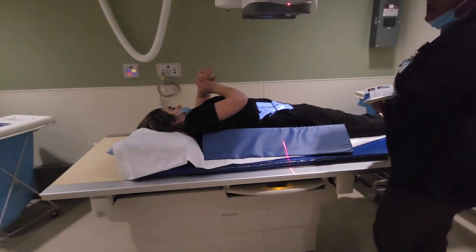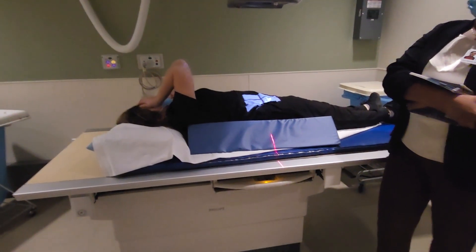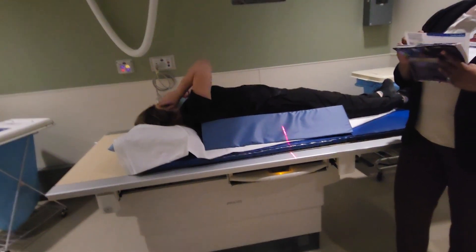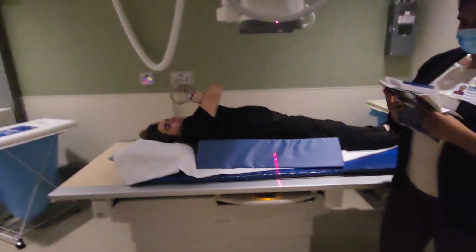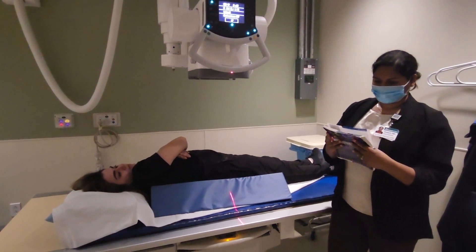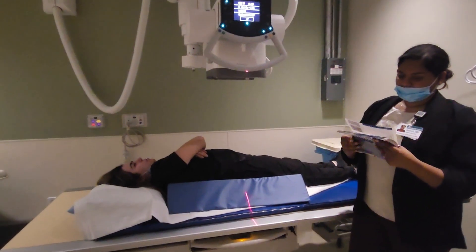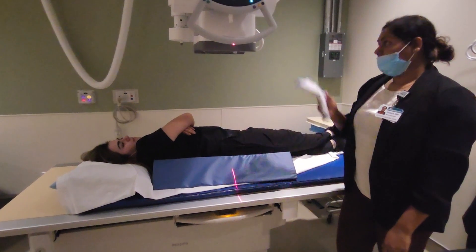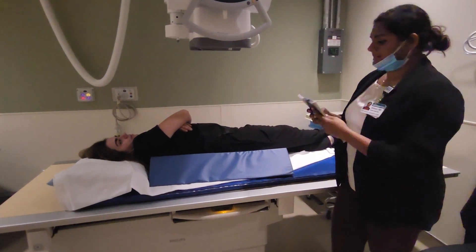So how do we do our AP SI joints? There's an angle — of 30 degrees — cephalic. And where do we center? One and a half inches above the pubic symphysis. For the AP SI joints, we do 30 degrees cephalic. For the oblique, there's no tube angle — we're just obliquing the patient 30 degrees.